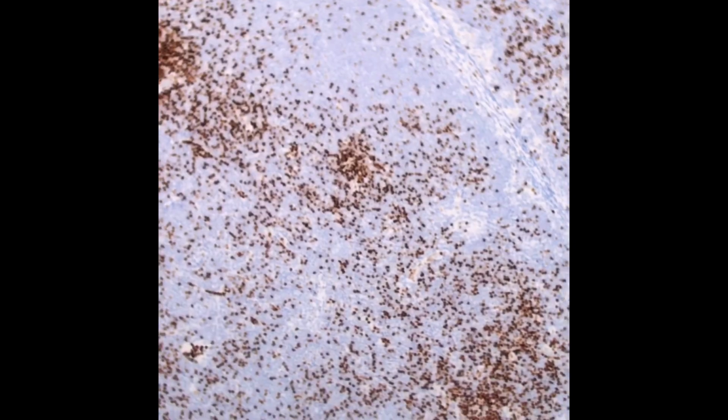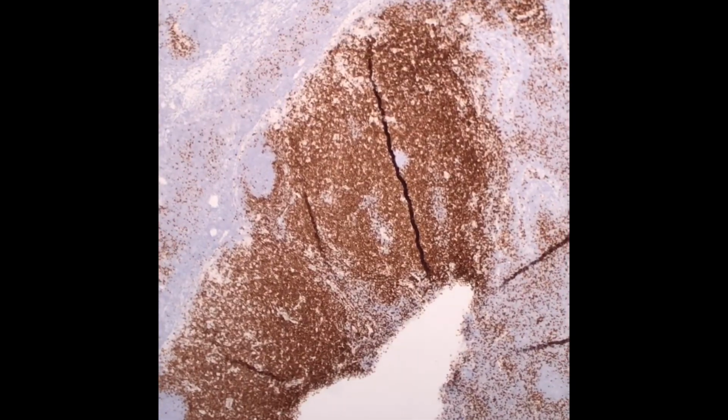And now, just for completeness' sake, when we think about small B cell lymphomas and leukemias, obviously CLL is by far and away the most common disorder. The flow cytometry here would be highly against it without a CD5, but I did take the liberty to do a LEF1 stain, and that can be positive in the vast majority of CLL cases. In this case, it's really only staining those T cell areas, again showing the paracortical hyperplasia areas, but as we get out into the infiltrating tumor, it's clearly negative.